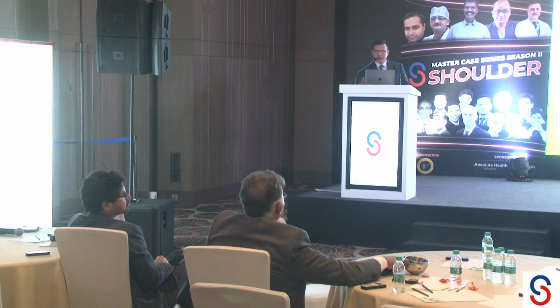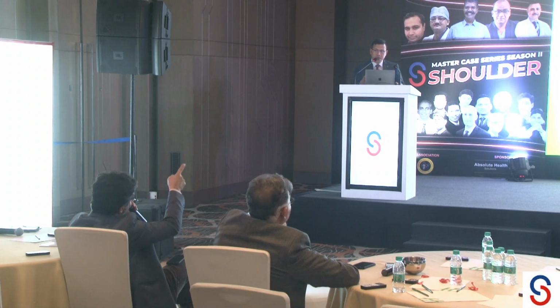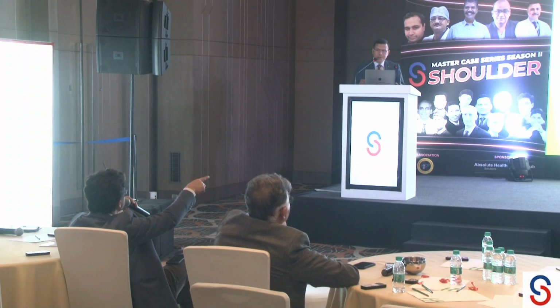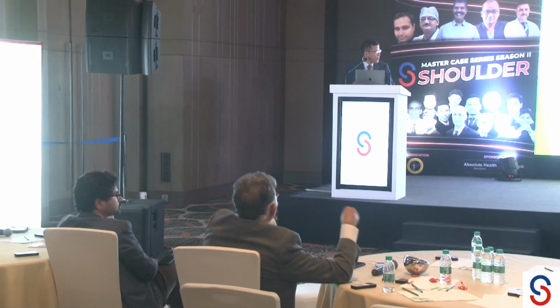And moreover, distalization has other flip sides also, like excessive distalization probably will lead to acromial stress fracture and deltoid dysfunction. That is where the point is. I think this patient, how many months was this follow-up? Now it is 15 months. 15 months, yeah. Thank you.